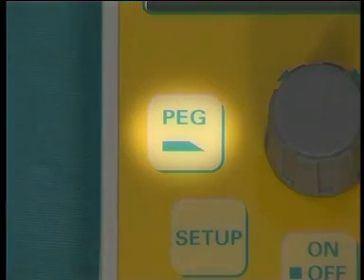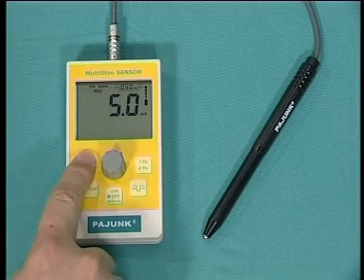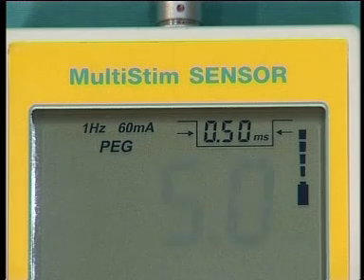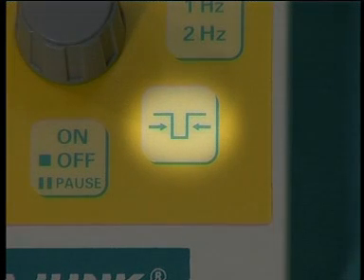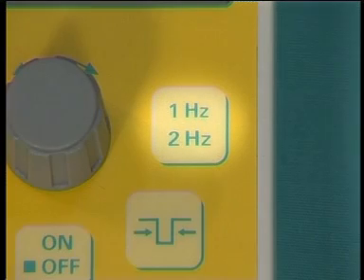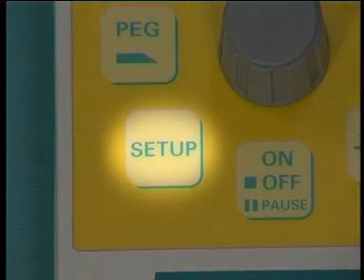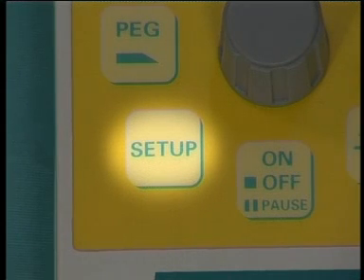To change to PEG mode, press this button. The display will then show the pre-programmed PEG setting up to a maximum of 60mA. The pulse width can be changed by pressing this button and then by turning the grey knob either clockwise or anti-clockwise; you can choose from between 0.05ms and 1ms. The frequency can be altered by pressing this button, either 1 or 2 Hz. You can pre-programme the sensor and set the volume of the audible bleeps to your individual preference by using the setup button and following the instructions in the handbook supplied with the sensor.